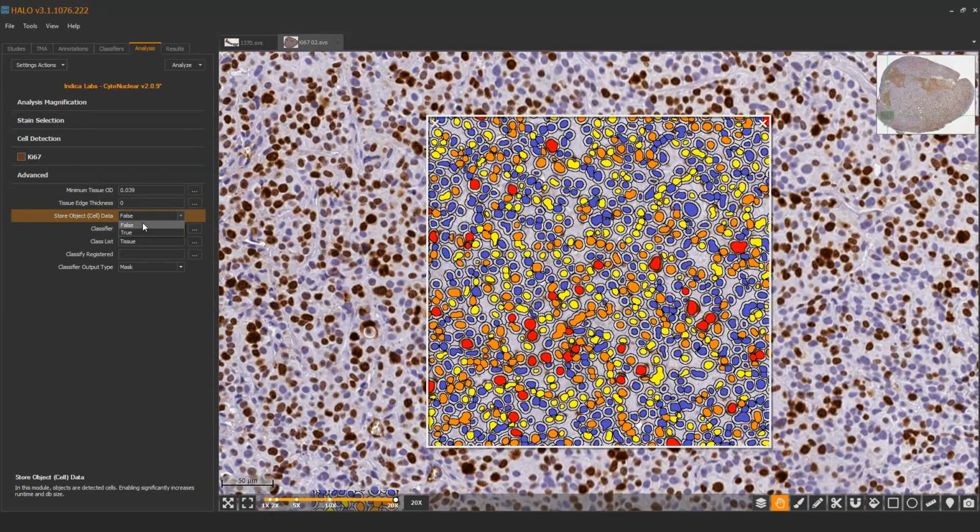Okay, let's select analyze, and we can analyze a few things: the field of view, any annotation layers that we've generated, or we can look at the entire image. Real-time tuning is the only option here that doesn't generate a data set. This is just collecting information on this window and allowing you to do your tuning.